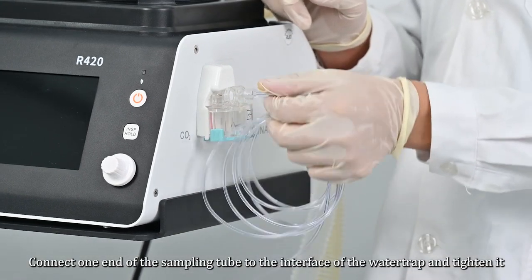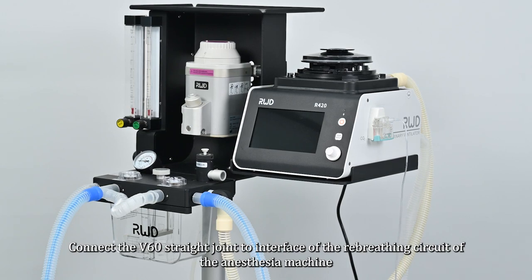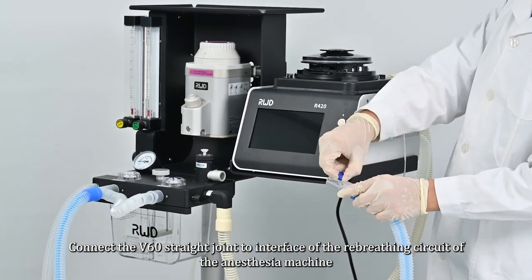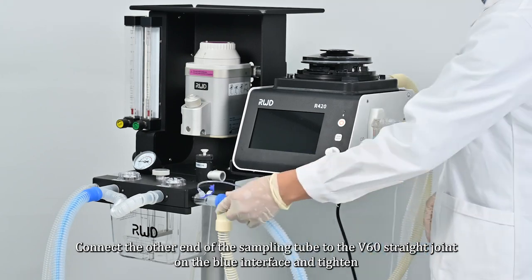Connect one end of the sampling tube to the interface of the water trap and tighten it. Connect the V60 straight joint to the interface of the rebreathing circuit of the anesthesia machine. Connect the other end of the sampling tube to the V60 straight joint on the blue interface and tighten it.